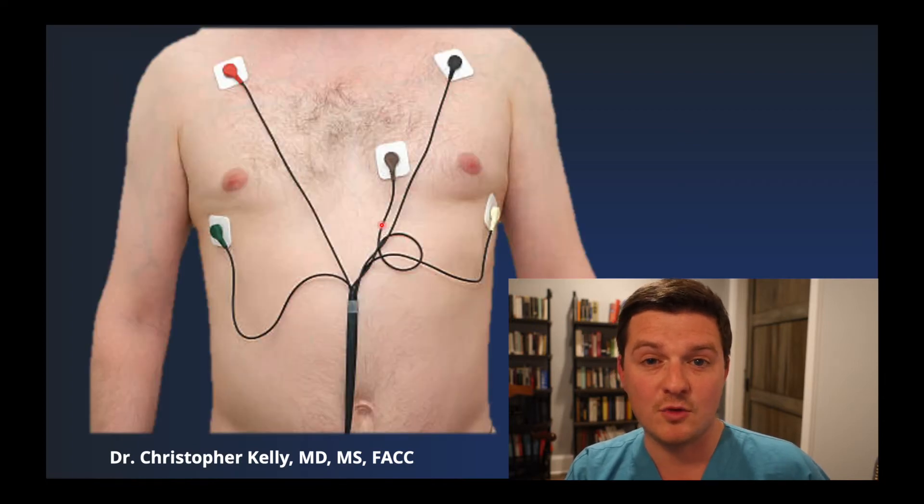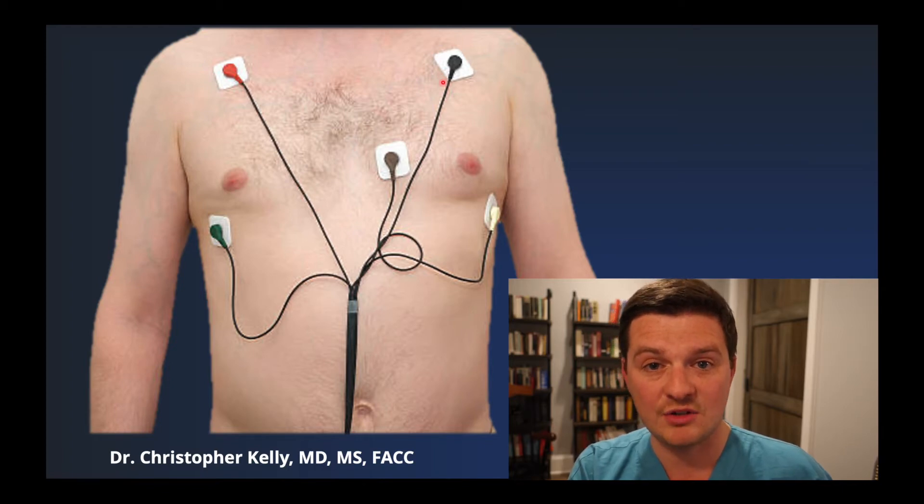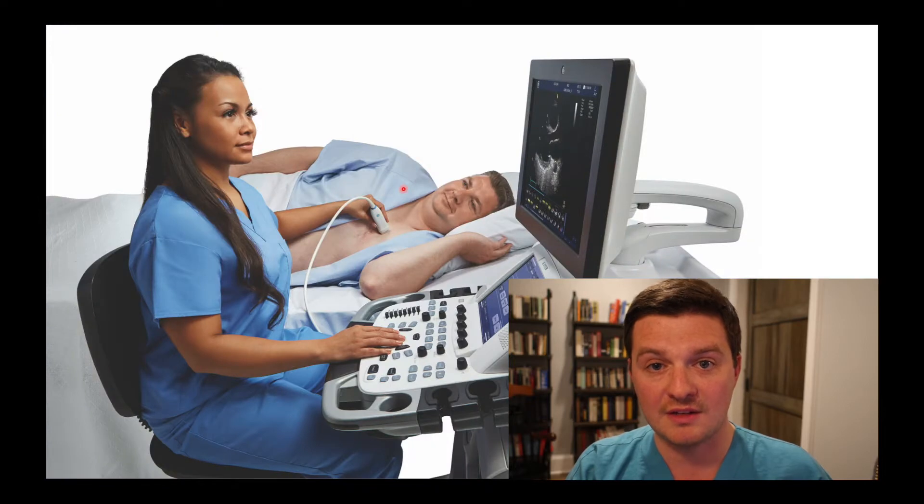The test begins by removing your shirt and having these white stickers applied to your skin. The white stickers are connected to wires which go back to the ultrasound machine, allowing us to measure the electrical signal coming out of your heart so that we can synchronize it with the pictures of your heart which we're taking with the ultrasound. After the stickers are on, you'll be put on a stretcher and rolled over to your left side, which brings the heart closer to the surface of the chest, and then a sonographer or imaging specialist will begin taking pictures.